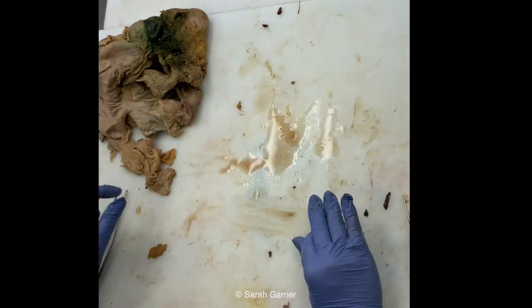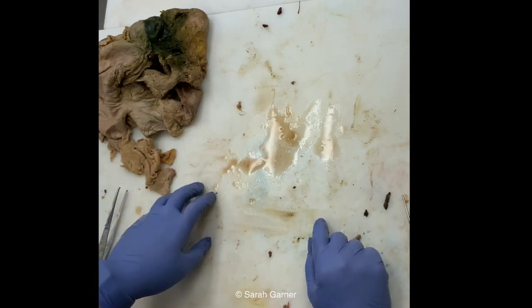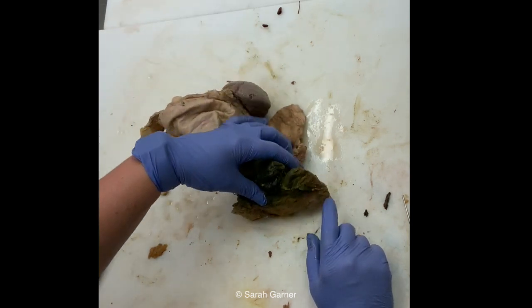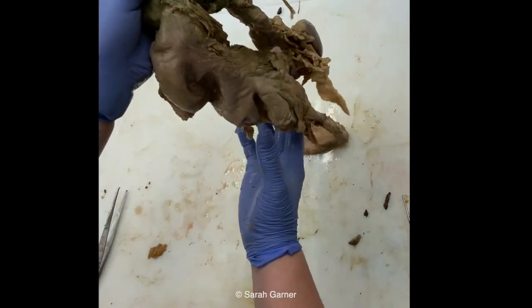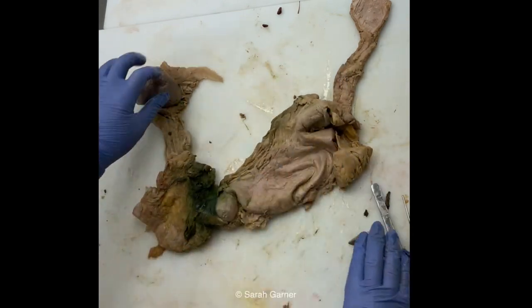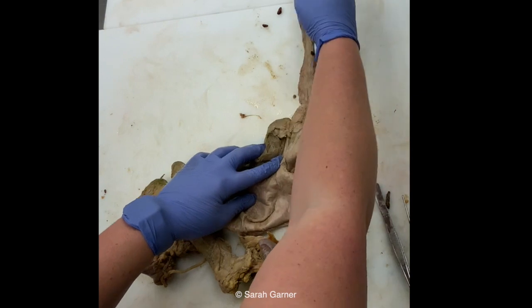Of course you would take sections of it, but for now you can kind of just set it to the side. The other thing that usually you should note in your report is the patency and the thickness of the bile duct. Depending on how you cut it, you may examine that on this portion, or you may examine that on the gallbladder, depending on how you like to dissect it. But that is something to note. So you should always probe pretty much everything and just note if it is patent or not, and also the diameter of the lumen.